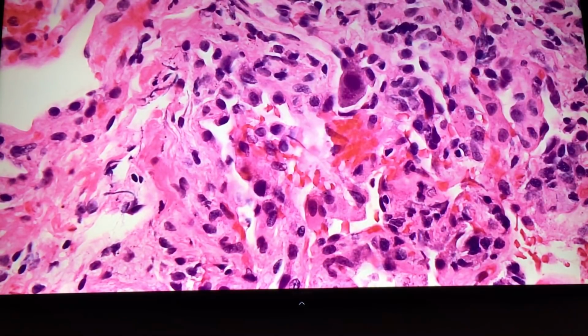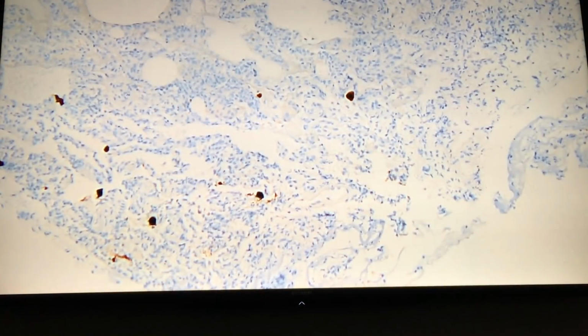So last slide and then we stop, because I'm going to show you the CMV immunohistochemistry. It's on the piece that's a little bit covered. No, there are better ones, like full-fledged dots. Maybe it's not that piece. Yeah, there. See, so those enlarged nuclear things are marked beautifully by the CMV immunohistochemistry. You must have seen this in GI and stuff like that. But in the lung also it works beautifully to confirm the diagnosis that this actually is CMV.